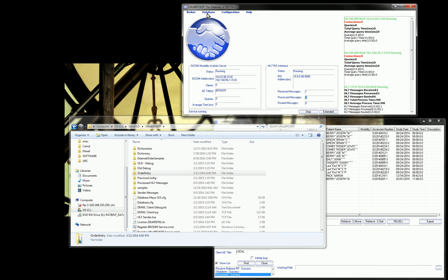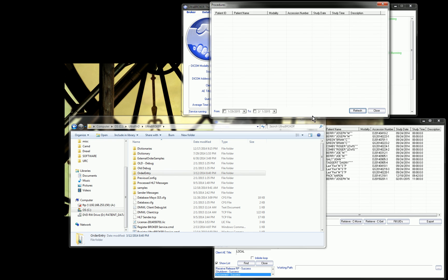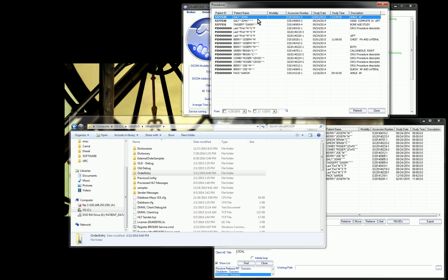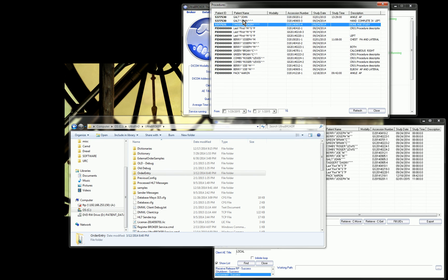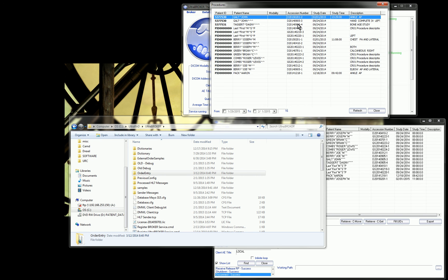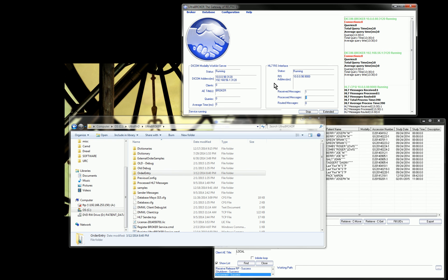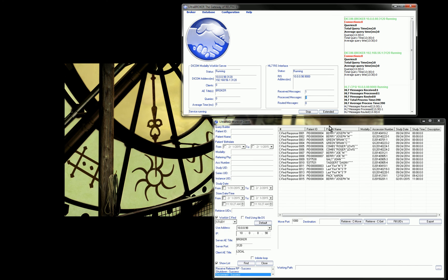You can see it incremented by 1. I've received that message. I can verify that I received it. I'm going to go to database procedures. I'm just going to throw everything up here. Here's that ankle that we just ordered from today at 1:29. It is in my system now. This is for HL7 sent to the broker. It would get stored in a local database in order to be provided to the modalities. Of course, this database would be truncated periodically. Old data would be removed. It's not very useful after the exam dates have already come and gone.